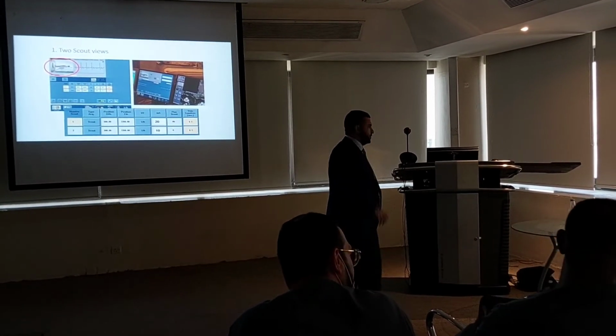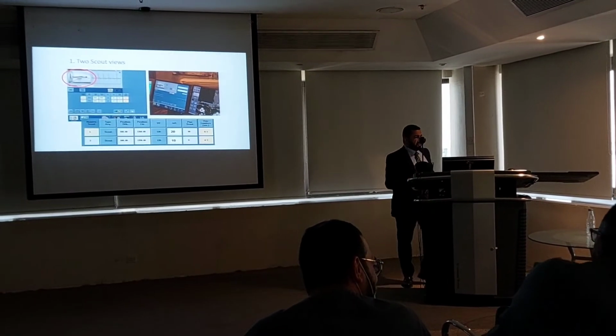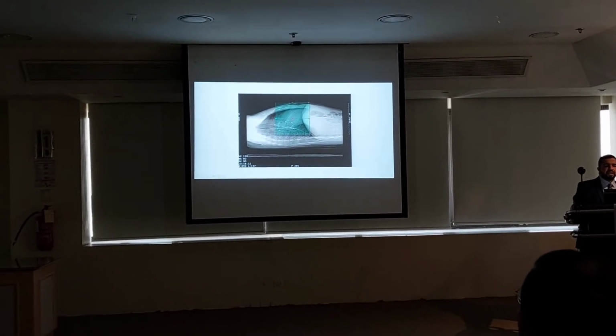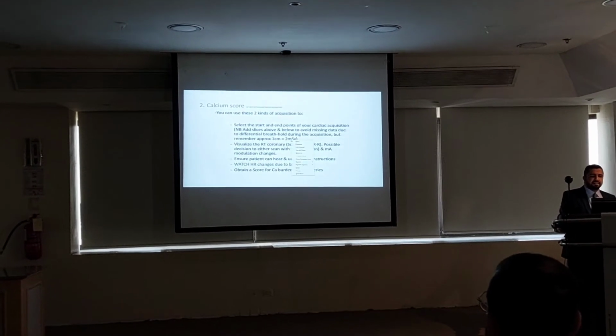Yes, we record that. It's not by GE messages, but we record. Okay? And then this is the lateral scout, and this is the AP scout, this is the scanning graphics.